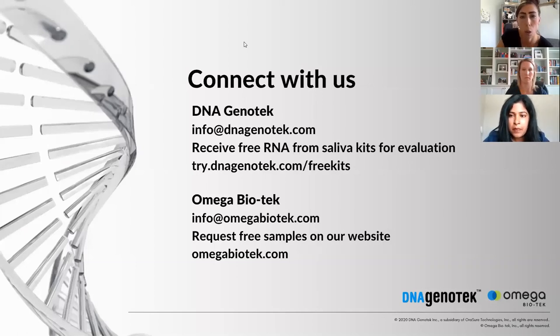Okay. Another question. Tara, are there any possible drug interactions with your chemistry such that patients may have to rinse out their mouth prior to collecting saliva? Yeah, so we've done extensive interference studies on our devices, and as part of our instructions for use, we include an initial warning at the first step that you need to wait 30 minutes minimum from the last time that you drank or ate prior to collection to avoid the inhibitors that could be present in the collected sample.